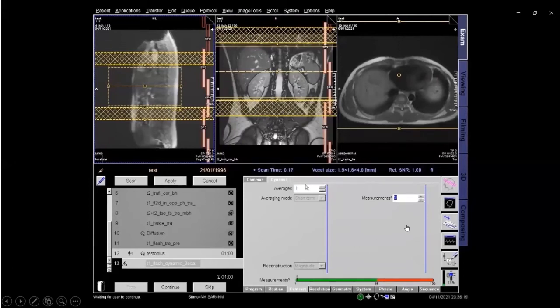Now here, see, if you're making 2 measurements, after the first scan, that is the arterial phase, we'll keep a delay here, a 15-second delay. That is to start the portal venous phase. Okay, and now we have made it 3 measurements, that is 3 scans. So after the first scan, there is a 15-second delay. After the second scan, we can make some more delay here. Okay, so you can make it 5 seconds.